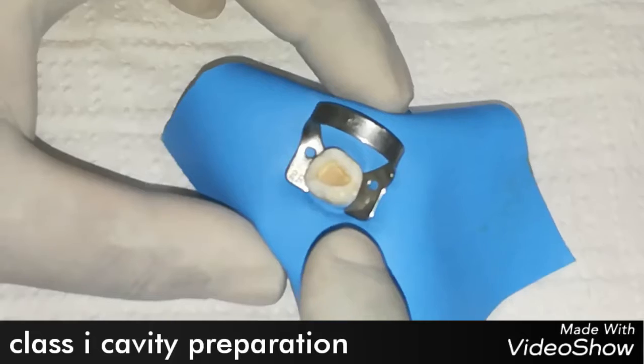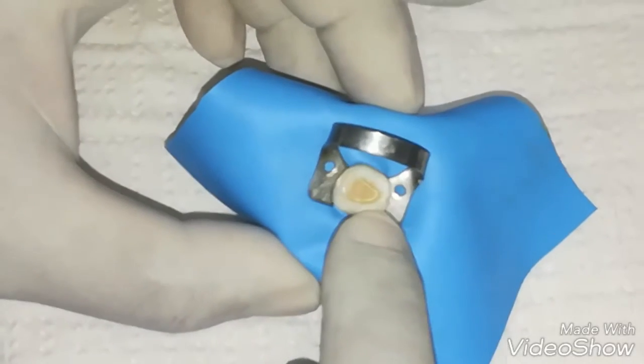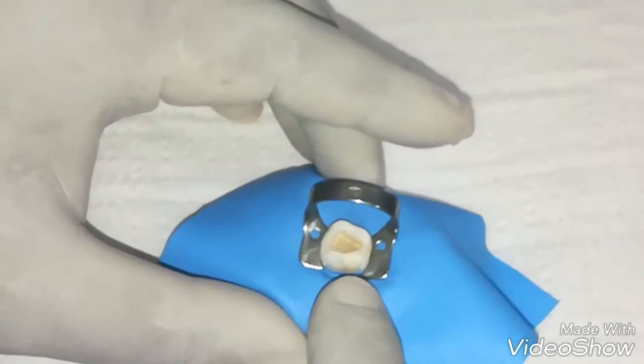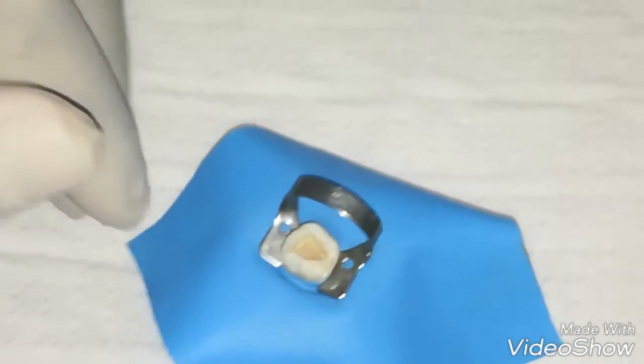Today I am going to show this class 1 cavity and use the injection molding technique with heated composite to fill up these class 1 cavities. So let's see how we can fill this cavity with the injection molding technique.